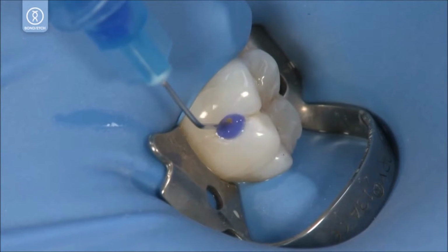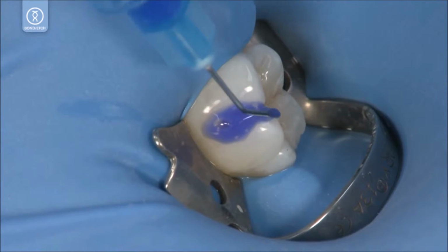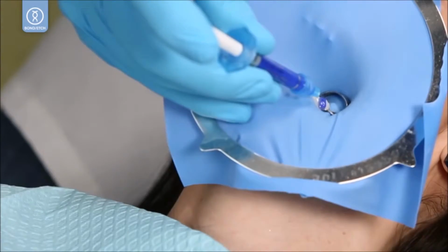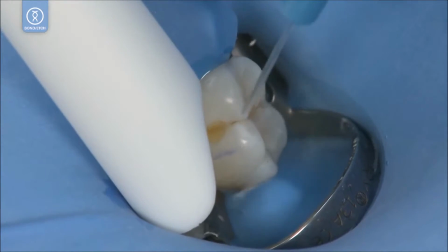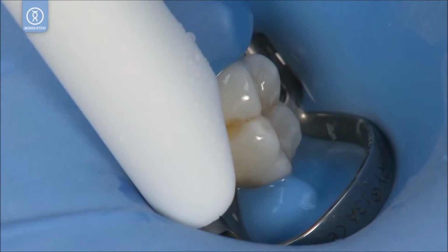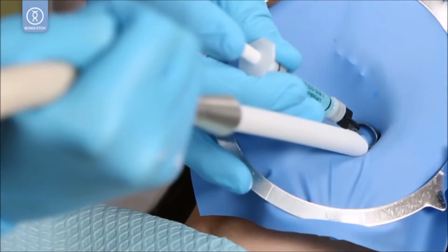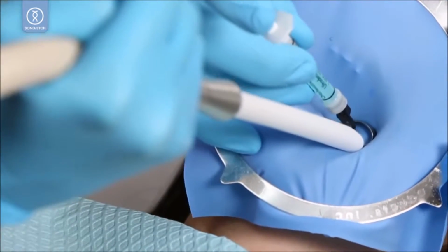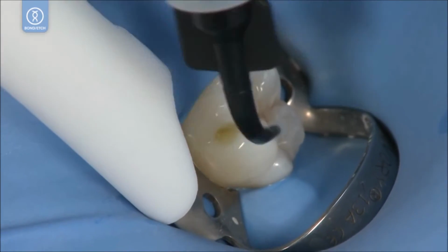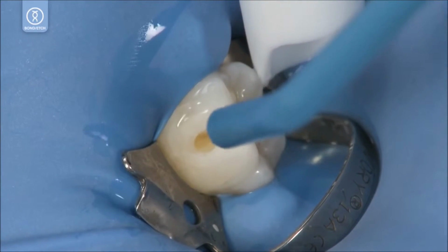Apply Ultra Etch for 20 seconds. Rinse and air dry. Leave damp. Optional. Disinfect with Consepsis. Air dry Consepsis, do not rinse.